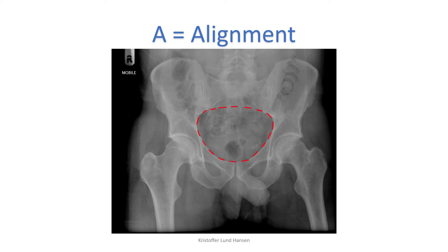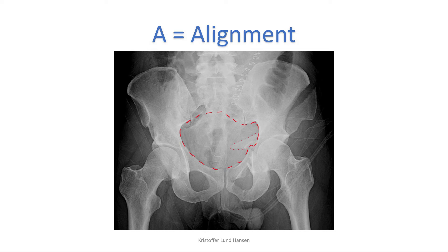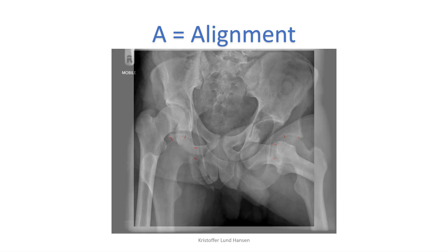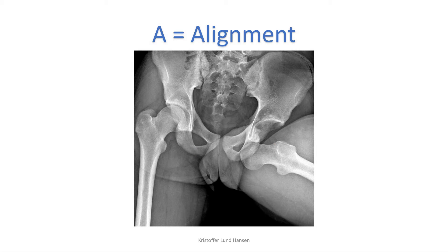Check that the pubic ring is symmetrical and located in the middle of the image. In this case, for example, the pubic ring is quite uneven, and it is a result of a traumatic fracture. There is also bone from the dislocated fracture of the iliac crest which can be visualized inside the pelvic ring. Third, check that both femurs are located in the correct position in their respective joints. In this example, the left femur is being dislocated out of the joint — a very common case, especially in older people and younger individuals with hip joint dysplasia.